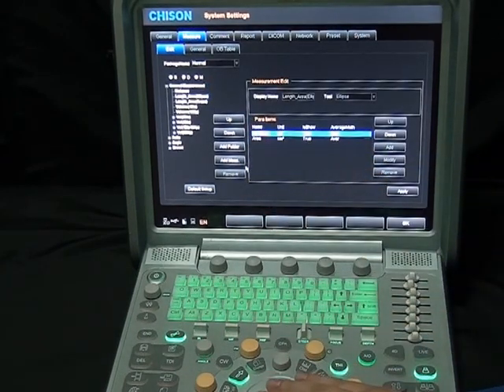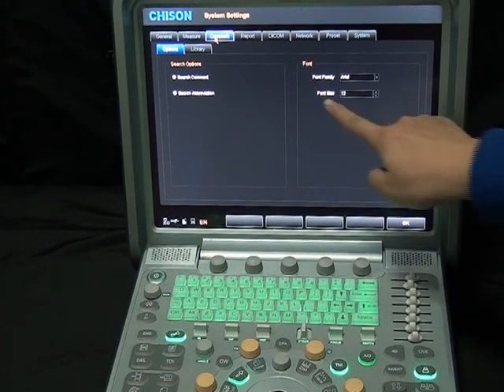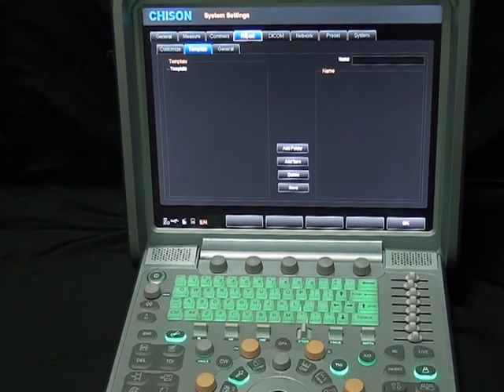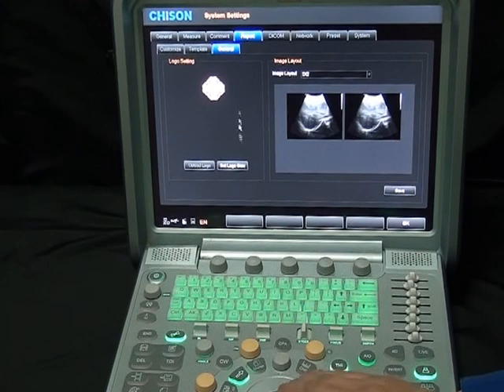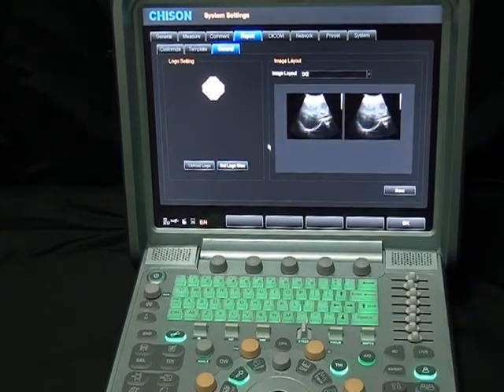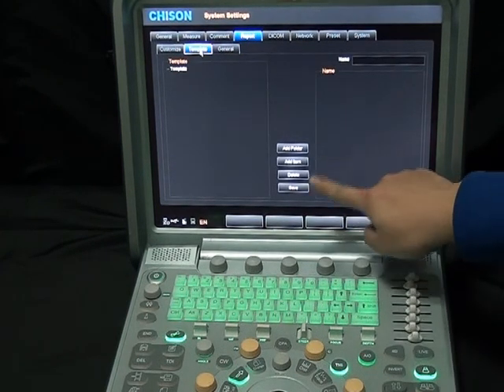In the comment interface, adding or deleting comments for each preset, as well as setting the font and font size of the comments, are available. Make your comments look specialized. What's more, in the report setting interface, you can set the hospital logo and the layout by yourself to make your report more personalized. Also, a report diagnosis template is available, which will be a great convenience for doctors' daily work.